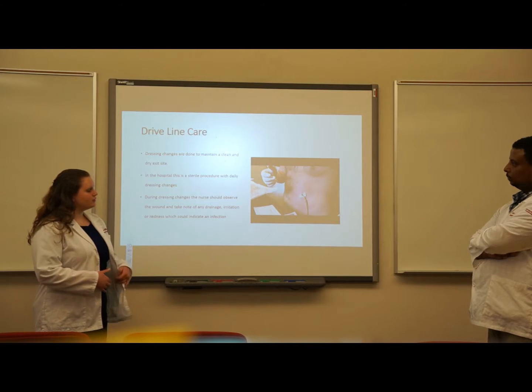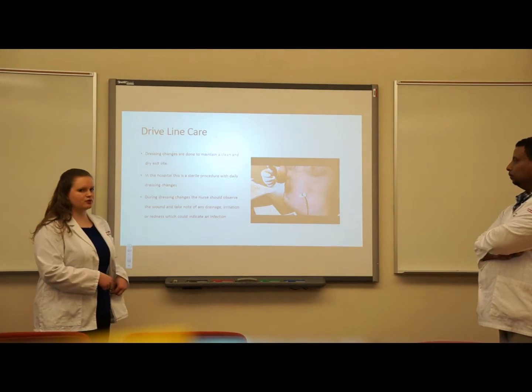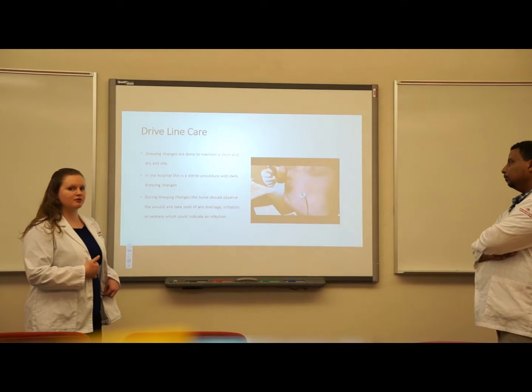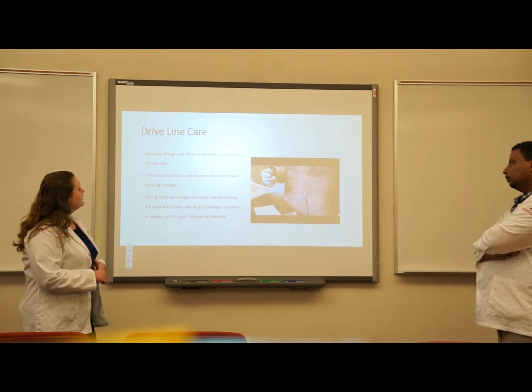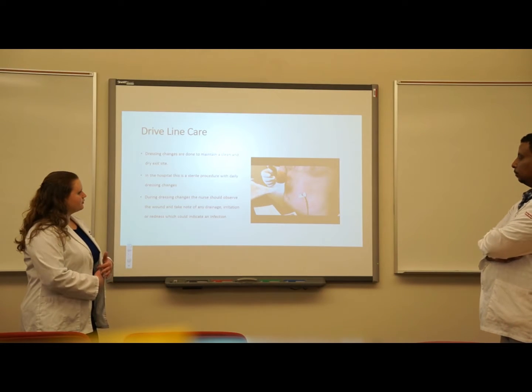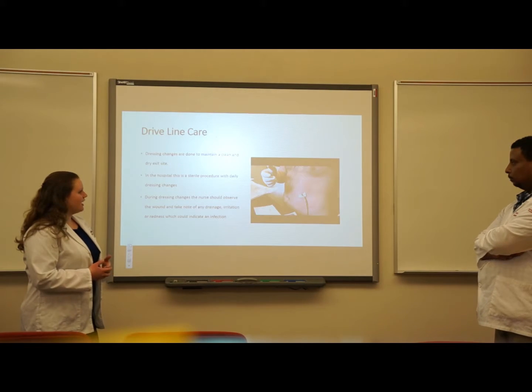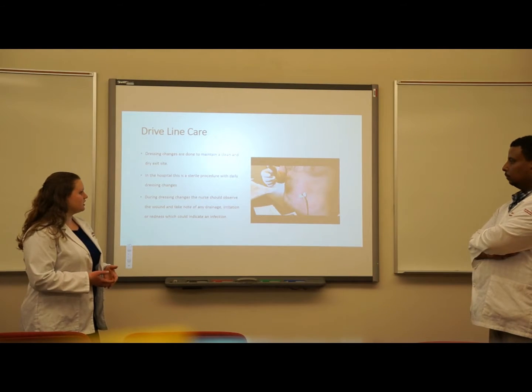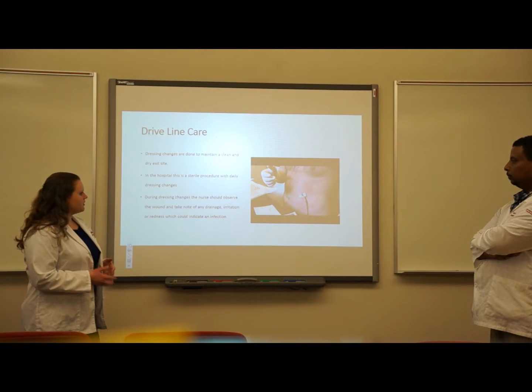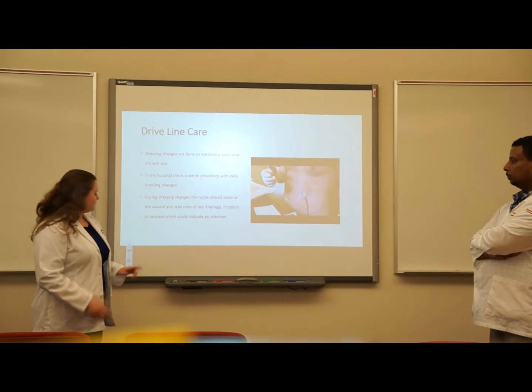Driveline care. The pump is connected through a driveline which actually powers the pump. The dressing changes are important because you want to make sure that it stays clean. In a hospital, this would be a sterile procedure with daily dressing changes. During a dressing change, the nurse should observe for any drainage, irritation, or redness that could indicate infection.